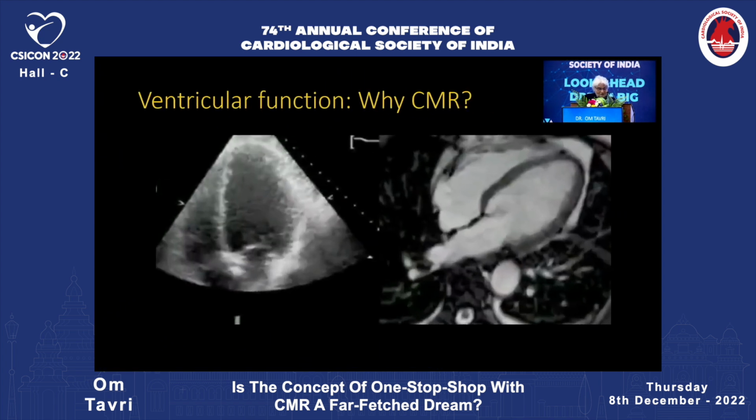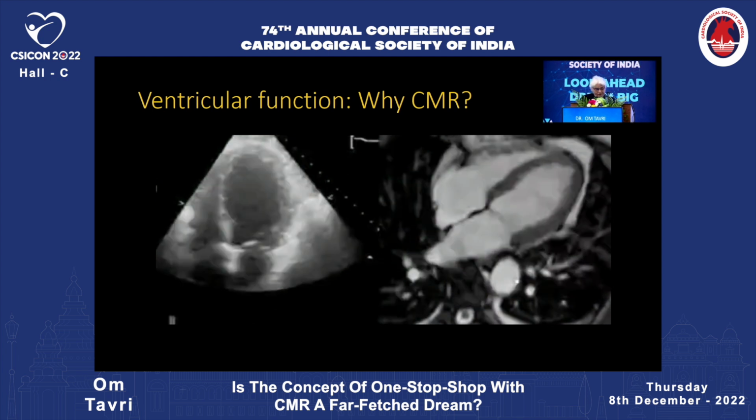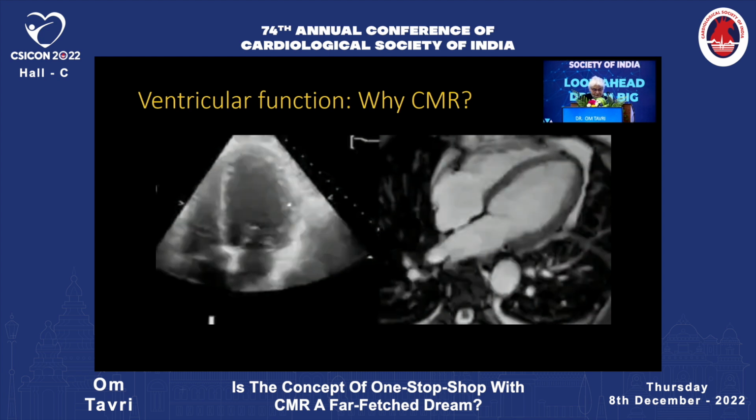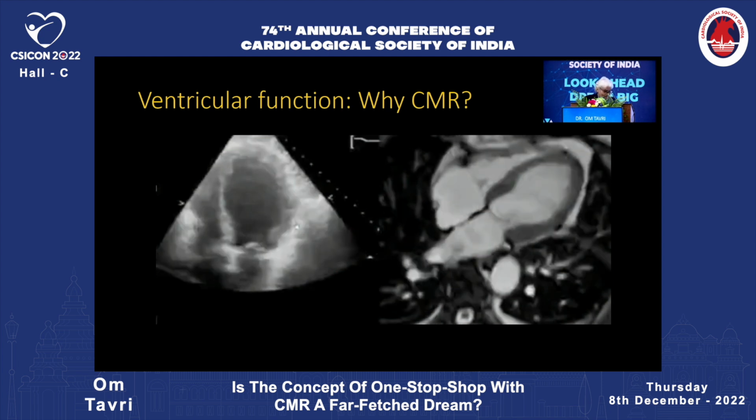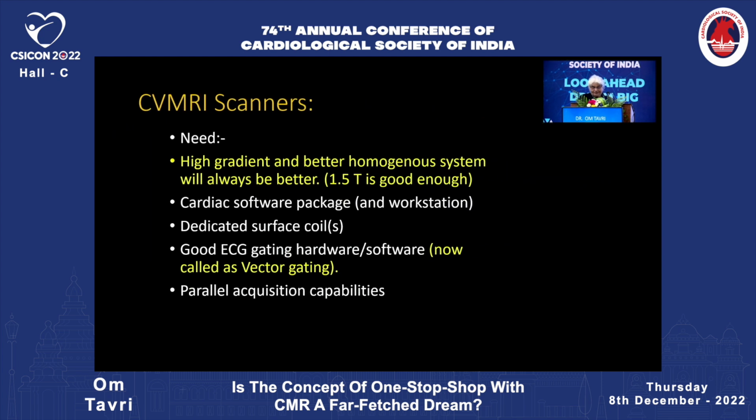Now see here tissue contrast. You can compare yourself. 4-chamber view, please run the video. 4-chamber view, it is automatic. 4-chamber view in the 2D echo and 4-chamber view in cardiac MRI. I had given the full video, I have checked it, please put automatic, it will run. So this is the advantage, where the apex is not very clearly defined on 2D echo and the epicardial area is not very clearly defined. That's a technological problem. Please run that, just see.